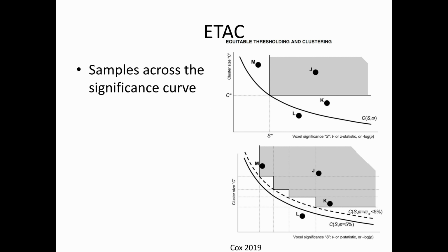And when I say liberal, I mean how often you get activations. So I would say that if you're using 3D t-tests, if you're working with AFNI and you can do a t-test, then doing it with ETAC is rational and reasonable. I tend to model things with a little bit denser, so in LME. So there, setting my p-value at 0.001 is sort of a solution so I can feel okay about my data and sleep at night.